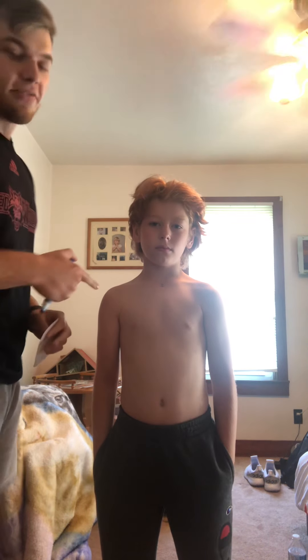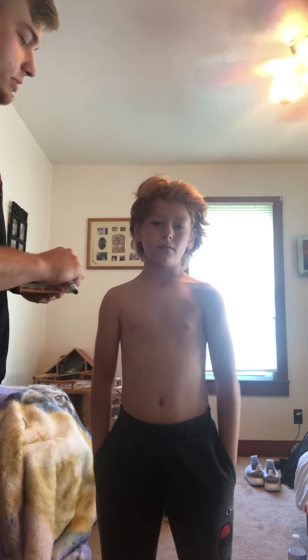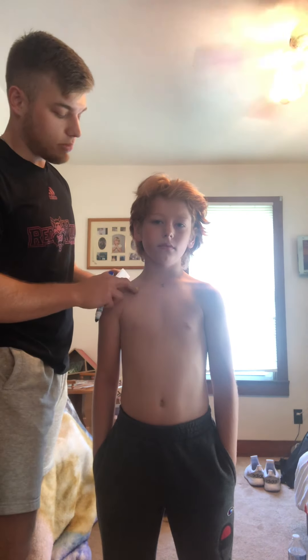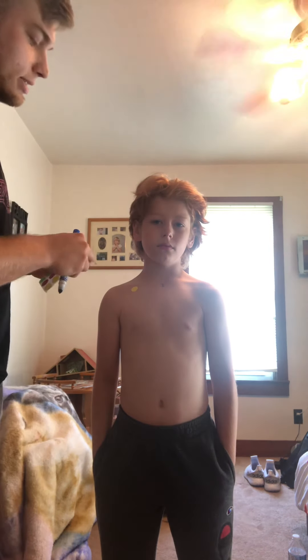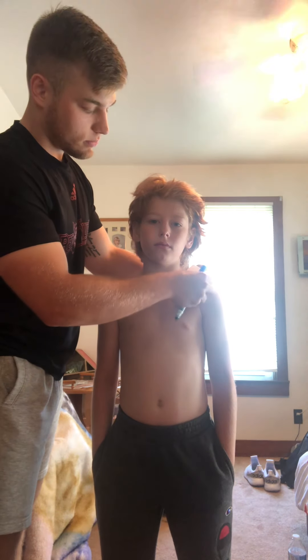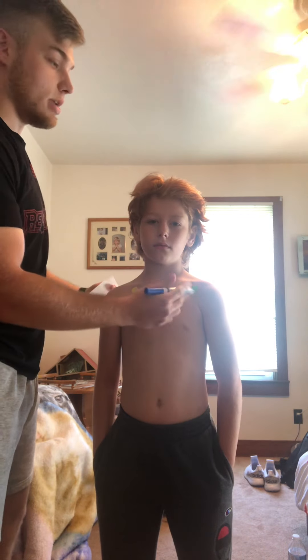Hi Dr. Drake. This is my nephew Ryan, he's gonna be helping out with the EKG Chapter 3 video. What we're gonna do first is place an electrode right here on the right arm, or in the upper arm area. The next electrode is gonna be on the left arm, and that's gonna complete Lead I, which is a bipolar lead.